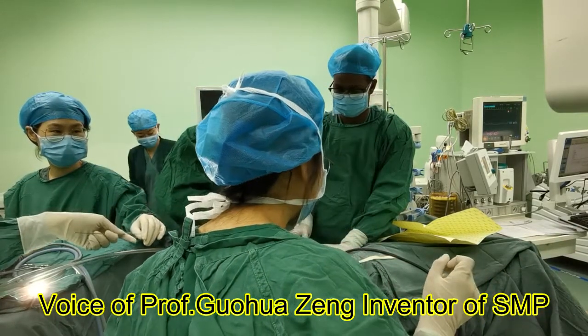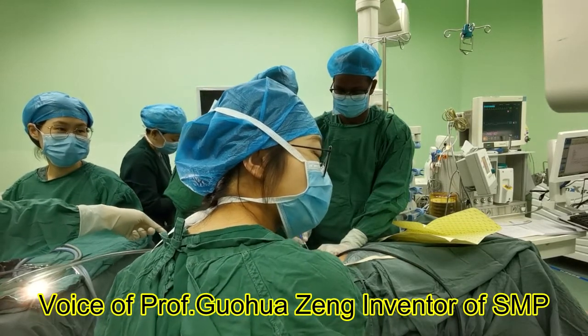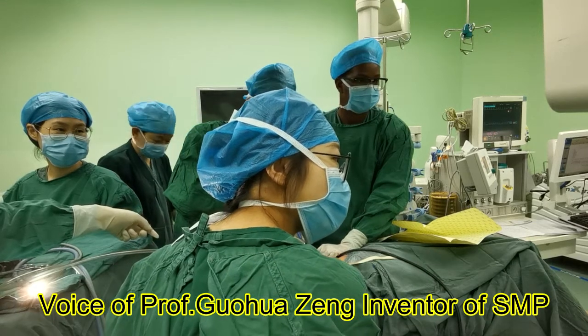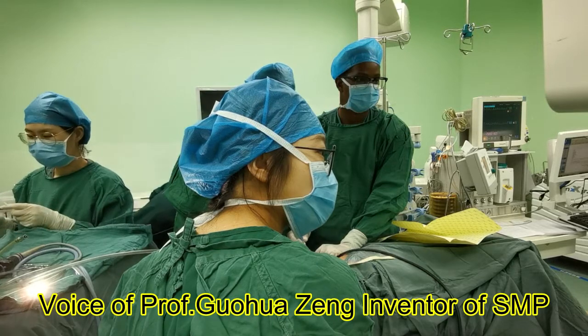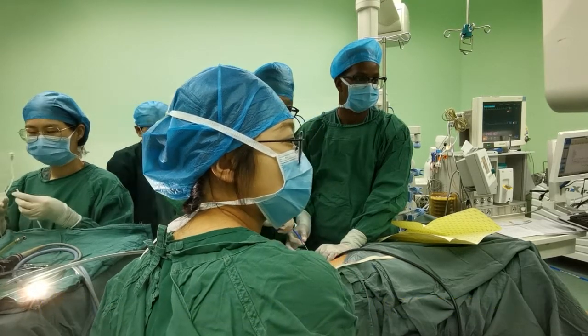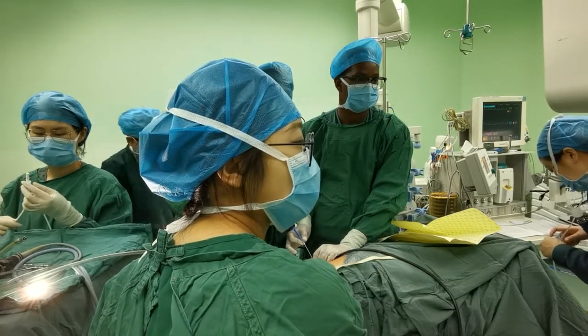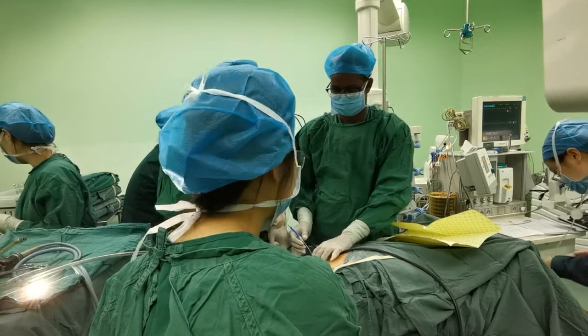After the operation, the patient is totally tubeless — no tube, no stent, no Foley catheter. This is real day surgery and makes patient recovery very fast. There is no need for extra stone extraction devices, and this greatly reduces medical cost.